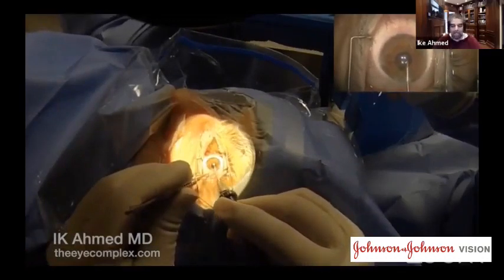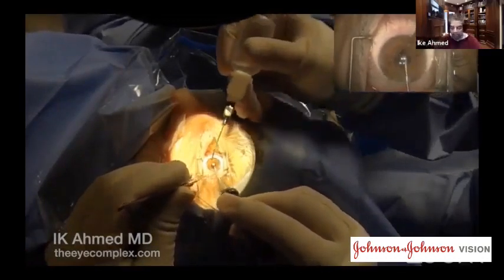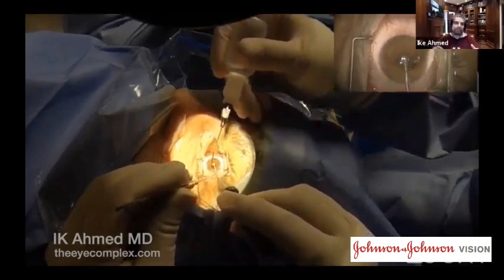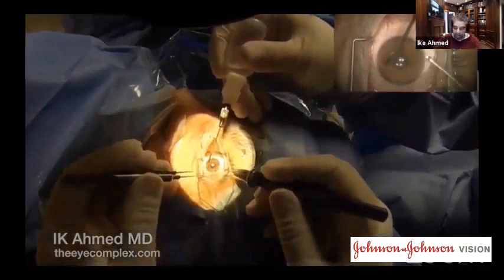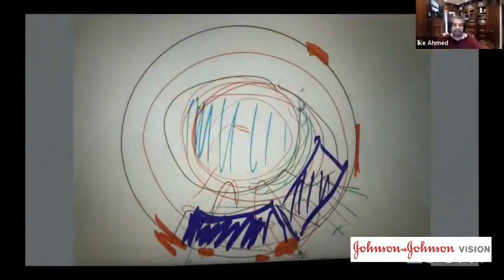So I just want to show that brief little tip to talk about hand position, arm position, and incision management as far as the microinstrumentation. I also like to plan my surgeries by thinking about my incisions. This is a case where I've been planning on placing a couple of iris prostheses in the bag for some sectoral loss of iris, as well as suturing the iris. And I've planned my incisions considering the long nature of that needle.